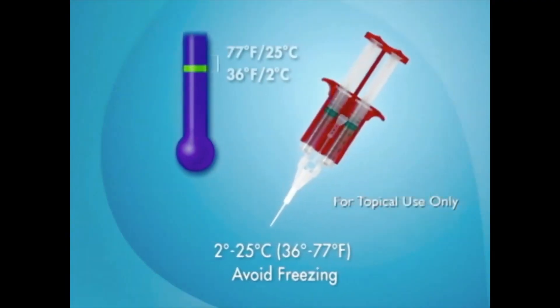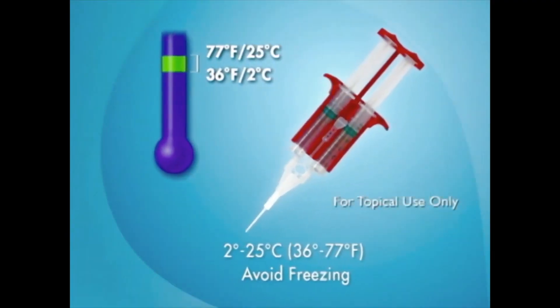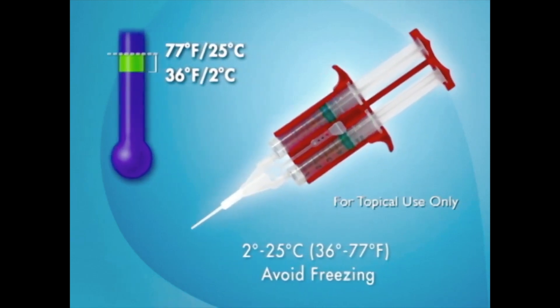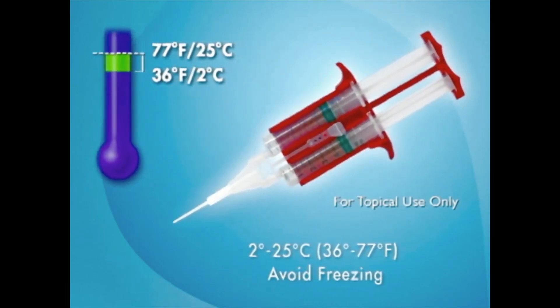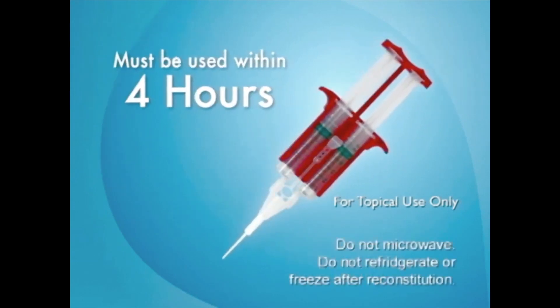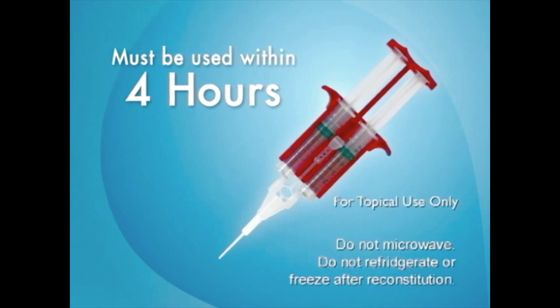For flexibility in storage at your institution, the Tisseal Fibrin Sealant Kit can be stored either at room temperature or refrigerated per the expiration date printed on the package. Once the product is prepared for use during surgery, it must be used within four hours.